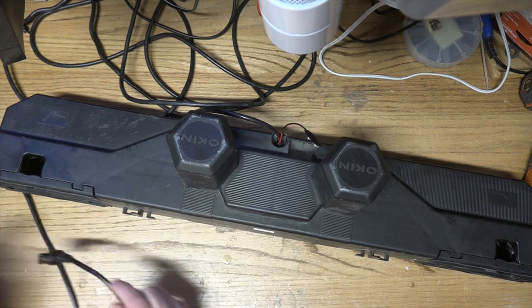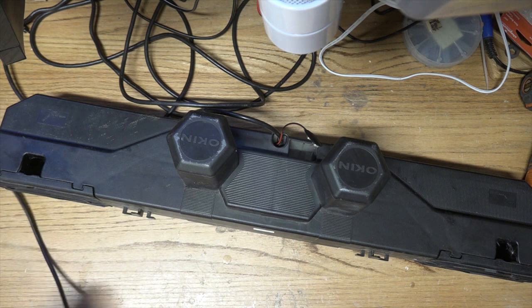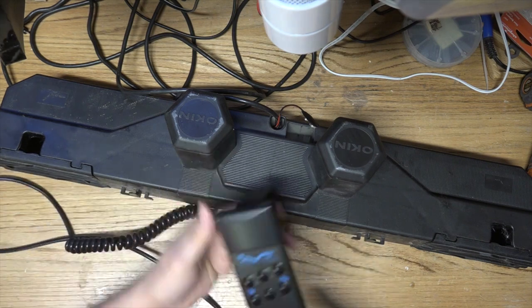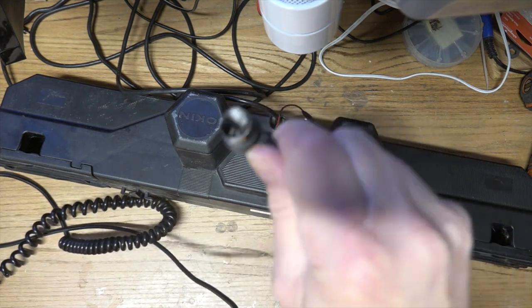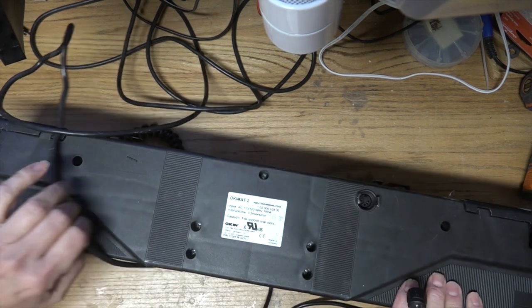The rest of the bed is gone. We couldn't find anybody that was particularly interested, so we went ahead and just recycled the metal portions of it. And I wanted to keep this to see what the heck it is and see how it works. So we've got this remote control here, and that goes through this little guy. Let's plug that guy in. And apparently, it takes a 9-volt backup. I have no idea.